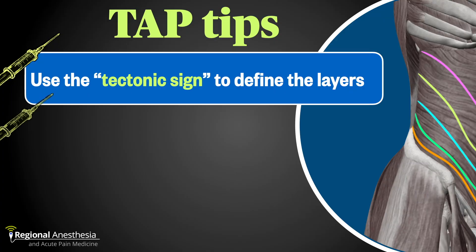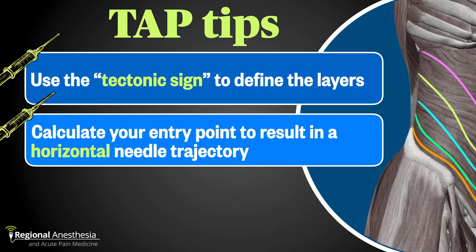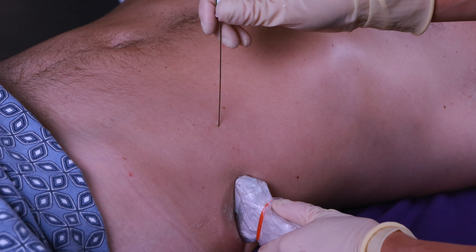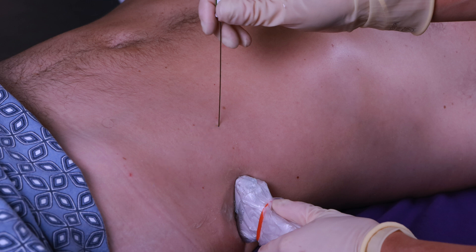Number two: you want to hit the TAP plane at a very shallow angle, because you need to move that needle along. If you have to turn a 60-degree corner after hitting the plane, it's not going to be a satisfying block. Calculate your depth to the TAP plane on the screen, then insert your needle that far out from your probe surface. To hedge for safety, you can always start by aiming laterally at your probe surface, and once you see your needle on screen, walk it down sequentially until you're in the correct plane.